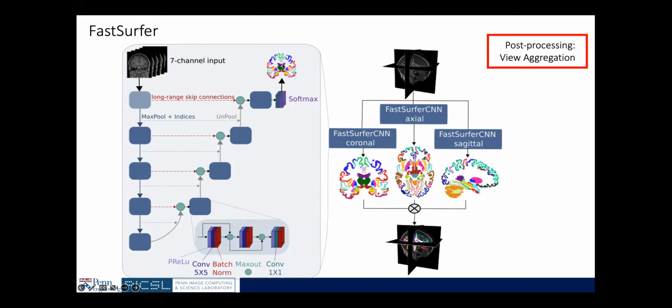the slices, right? But the thing to note in medical images is that you have 3 viewing planes: coronal, sagittal, and axial. So you can run this network on all different planes, one after the other, right? So you can get segmentation for all the coronal slices, then all the axial slices, and then all the sagittal slices, right?